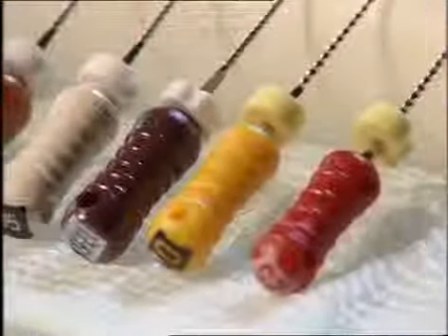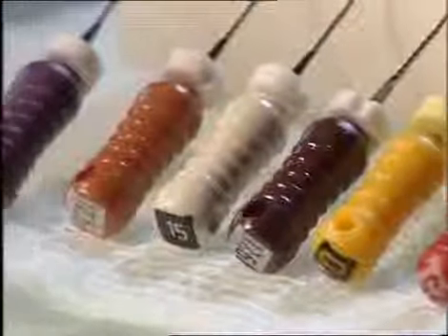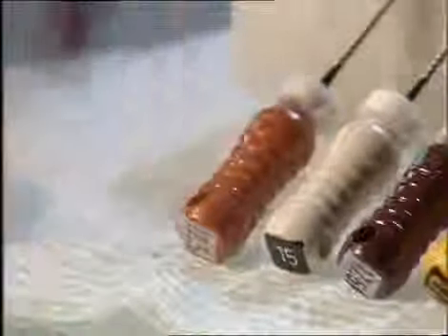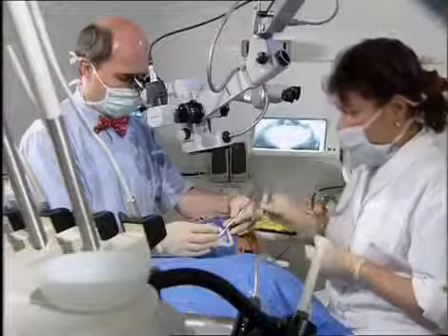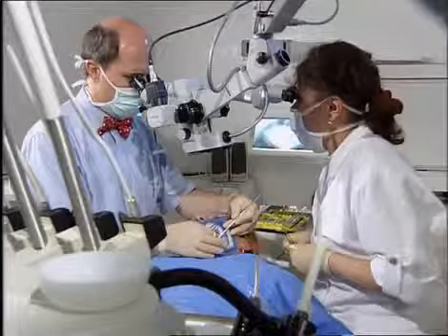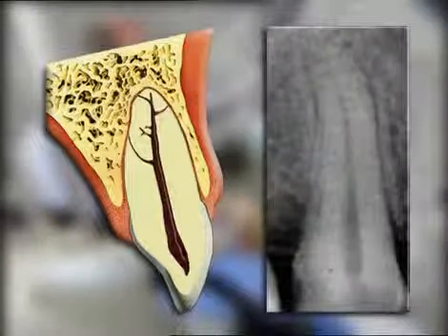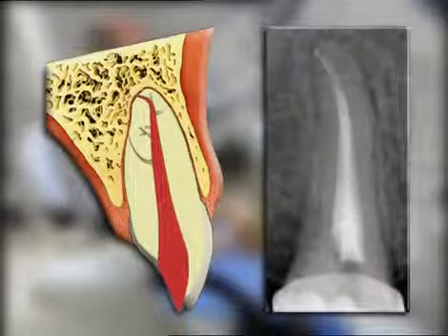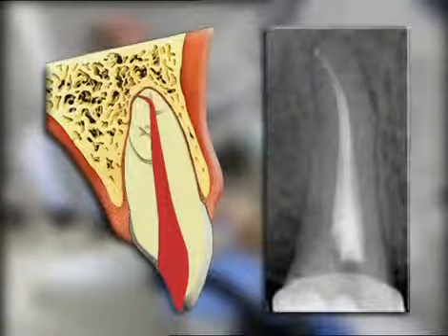In order to explore the specific anatomy, pre-curved small K-files are used first. The pre-curving depends on the root canal anatomy. Herbert Schilder taught endodontists to think in the third dimension. His five mechanical objectives for successful cleaning and shaping were first introduced in 1974. A continuously tapering conical form is developed with the narrowest cross-section diameter at its terminus.